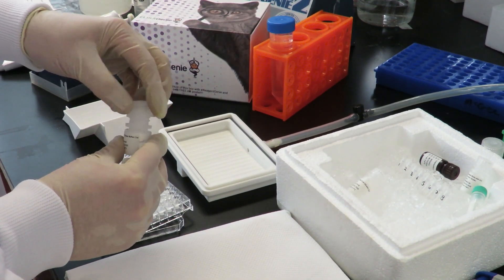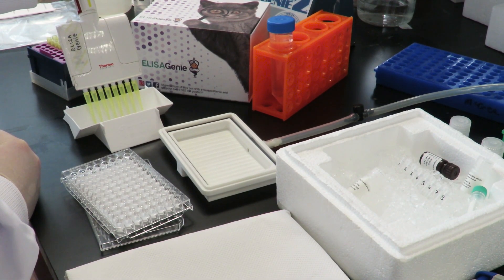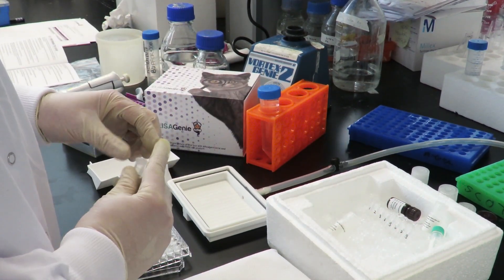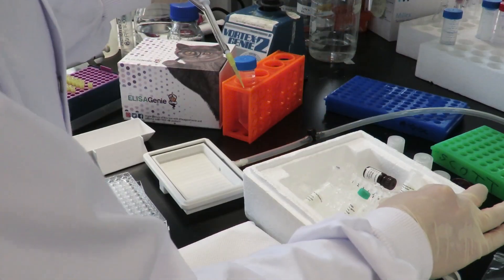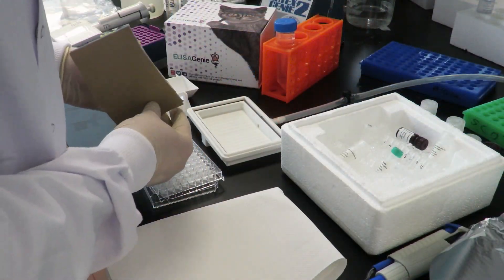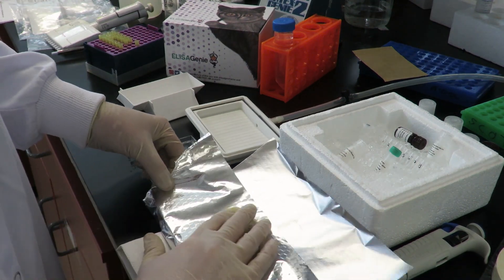Next, add 30 µL of assay buffer to each well, followed by the addition of samples and standards. Cover the plate with the seal, wrap in tin foil, and incubate for 1 hour at room temperature on a shaker set at 700 RPM.